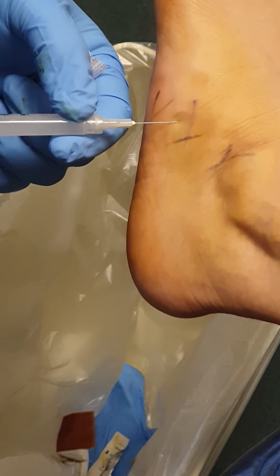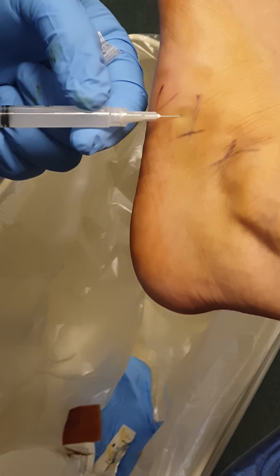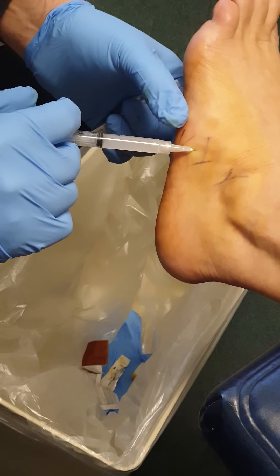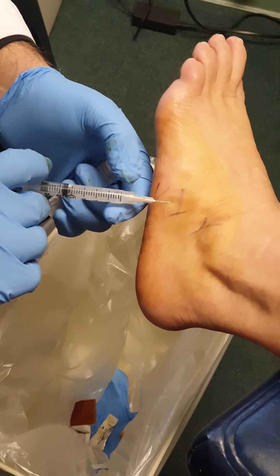Nope, just a little pressure. Okay, good — a little pinch, a little pressure. So what we do is a little bit of fanning. As I'm going in, I'm rotating my needle.